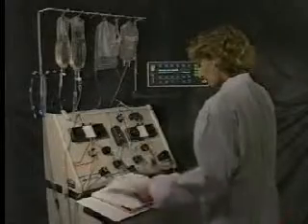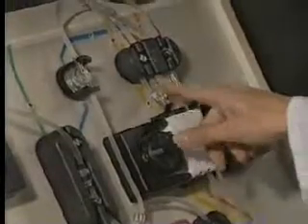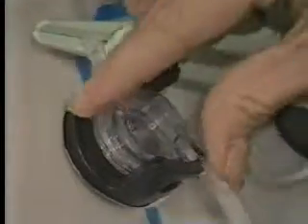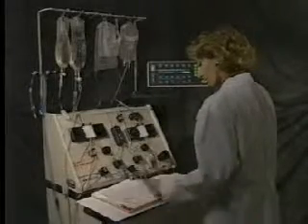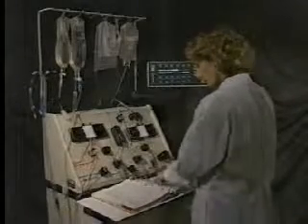As you become familiar with the machine, it is important to have the operator's manual close by and to be comfortable using it as a reference tool during troubleshooting. This specific video training focuses only on common alarm conditions that occur during the prime mode. It is important to note that the alarm recovery procedures shown in this video may differ from the procedures used when a patient or donor is connected and the system is in run mode. Let's review a few alarm messages and practice using the operator's manual and the troubleshooting chart for troubleshooting prime alarms.